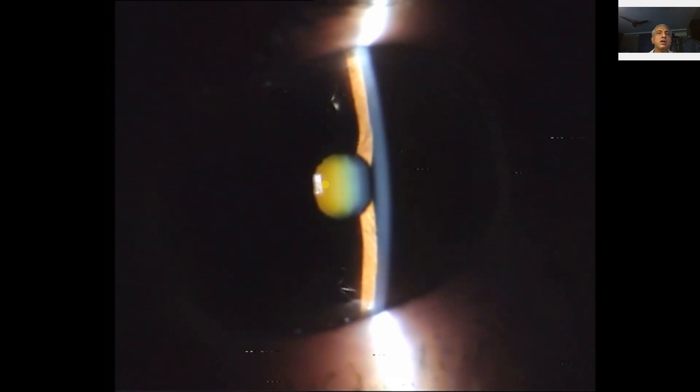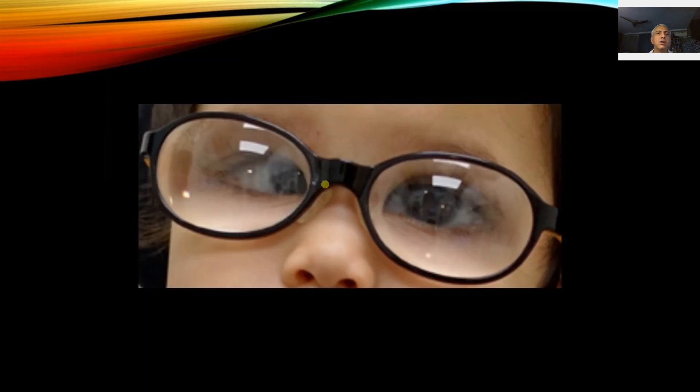Looking at the nucleus sclerosis, you can see it's producing a dense greenish color appearance. If you had dilated the pupil, it would have a brownish tinge as well. You don't dilate patients with shallow anterior chamber because you can induce angle closure glaucoma.